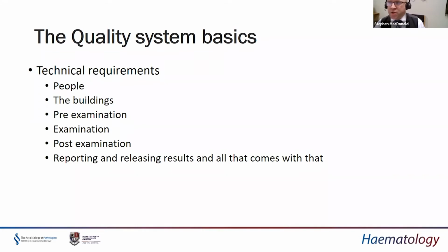And then there's the section that's most important, or that we have most control over in the laboratory, and that's the examination procedures. So laboratory testing and all that comes with that. But once, as I said before, once we produce a result, our role doesn't finish there.